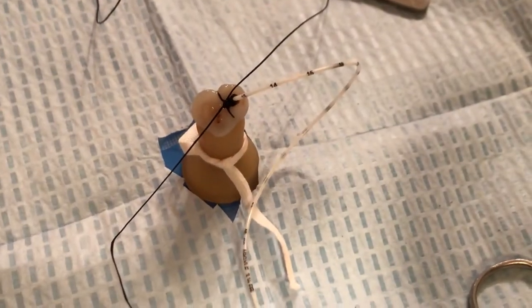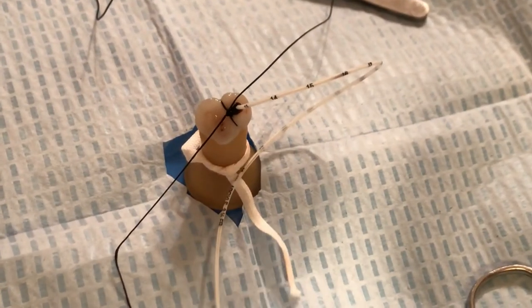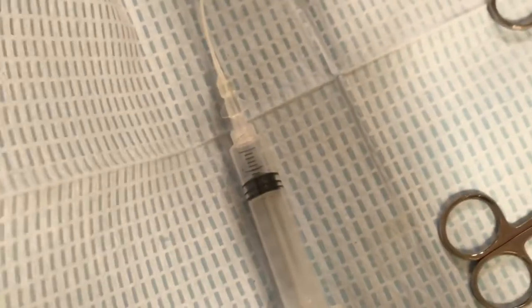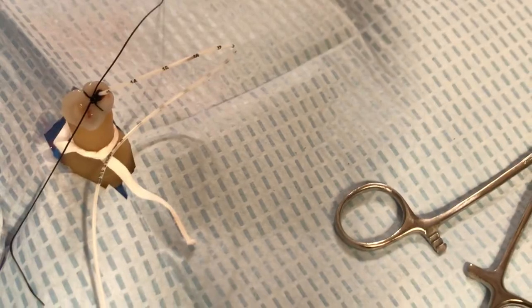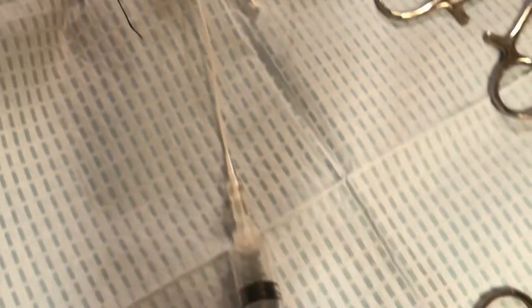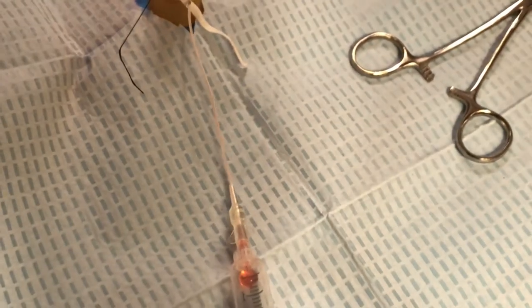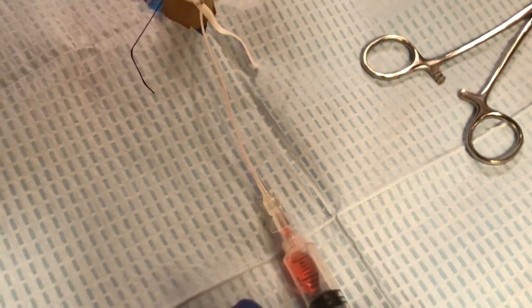Next, we want to draw back to ensure that there is blood return, and that's something you want to definitely do before you exit your field. There can be times when we suture so tightly that we're not able to withdraw blood. And there we have a blood return, so we know our sutures are not too tight.